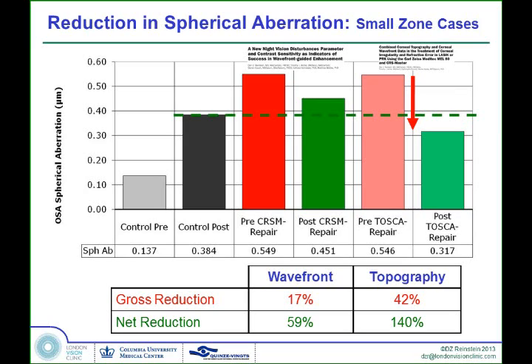Of course, even if you consider that there was a large decrease, if you look at what the control group, going back to the original control group, ended up at, in many instances the amount of benefit brought these patients to an even lower level compared to the aspheric profiles that we're using today. And the same applies to hyperopia.